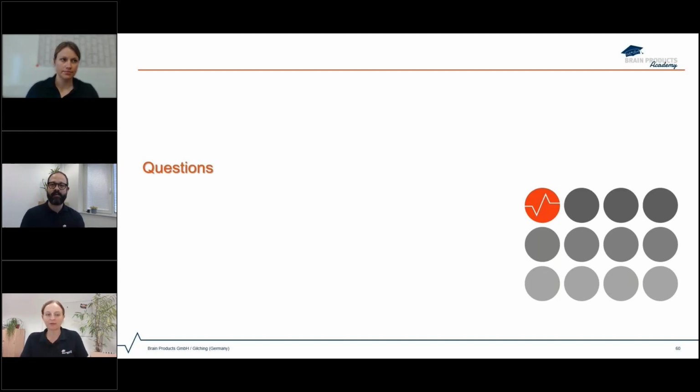We have a few minutes left for some questions, so I would start with one for you, Celia. You mentioned respiration effects in the BOLD data. Is it possible to model those, and if so, how would you do it?